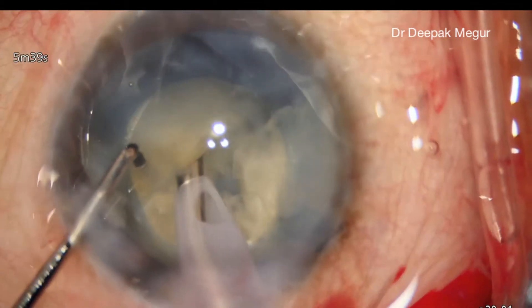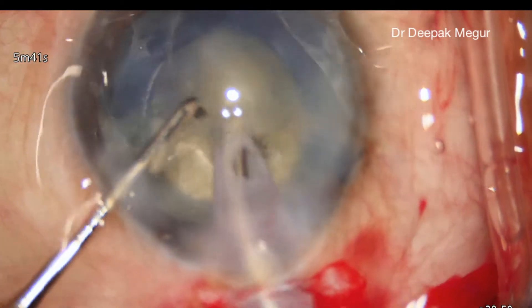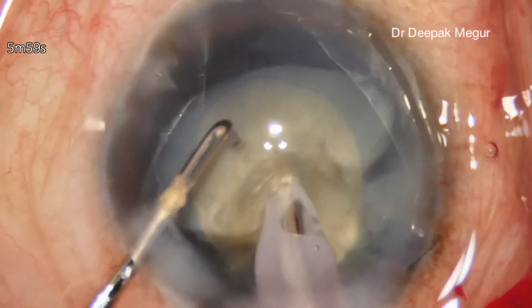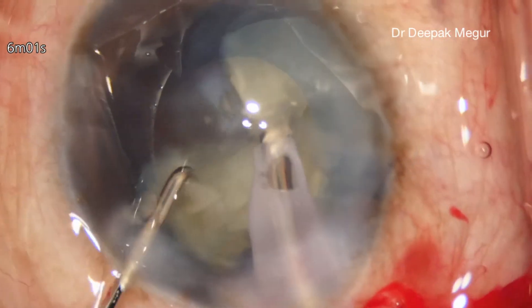The process of phacoemulsification is very similar to that of any other case. We divide the nucleus into multiple small fragments and then remove it.